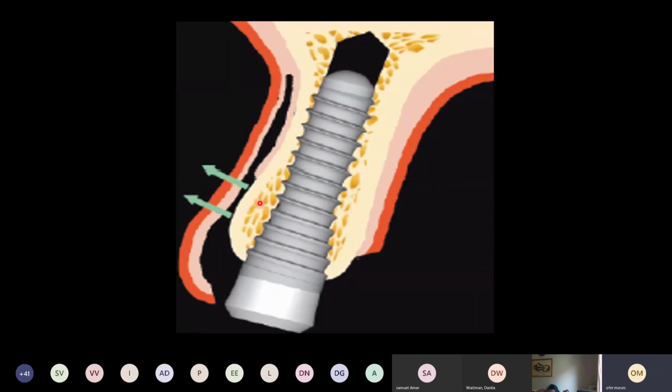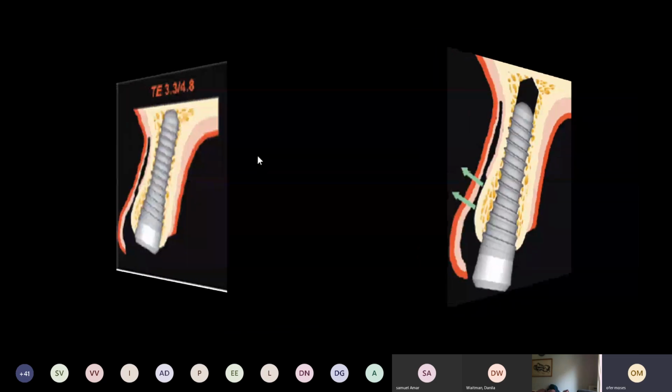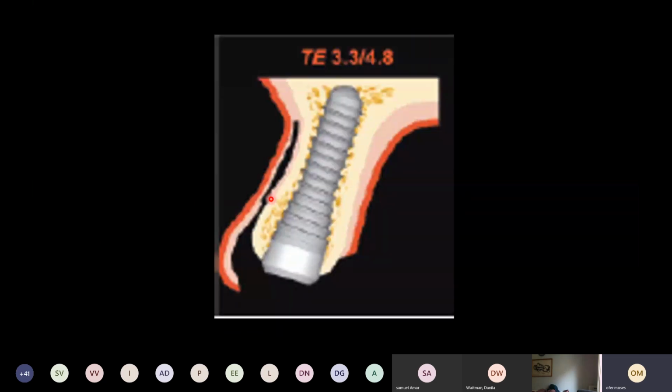And again, as you saw before, this is the area of the full thickness. Here you stop doing the full, and you start here the separation between the periosteum and the soft and connective tissue of the flap. Beware not to make any perforation in this area, and this you can achieve just by putting your knife parallel to the mucosa, as you can see here. And if you keep it, then it will be okay with you.